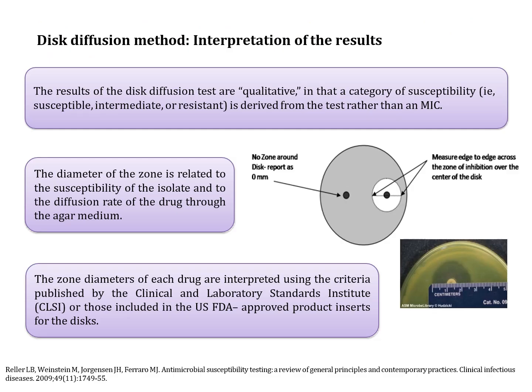Regarding the diffusion method, the bacterial sample is inoculated onto the culture plate. After an overnight incubation, when we get a colony, it is subcultured onto a sensitivity plate, and over it the antibiotic discs are placed. After an overnight incubation, the zone of clearing around the antibiotic disc is interpreted to determine the antibiotic as sensitive, intermediate, or resistant.